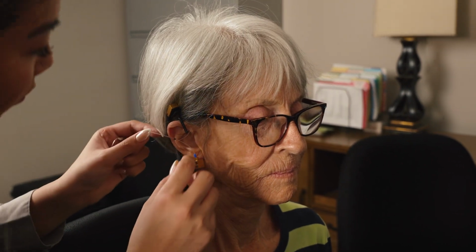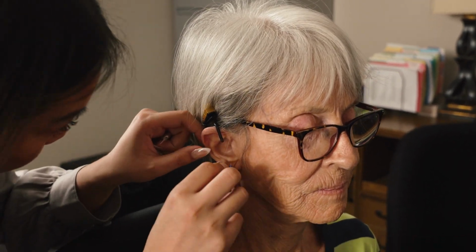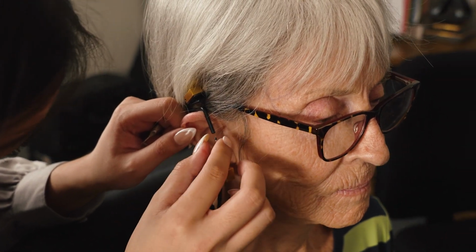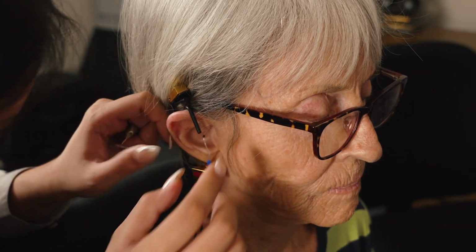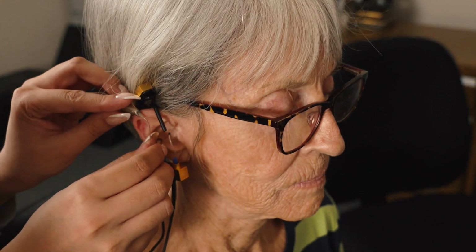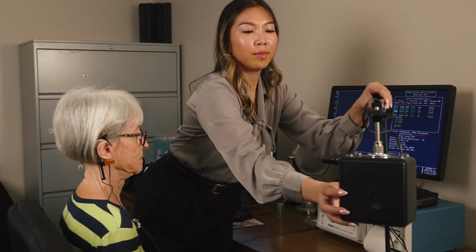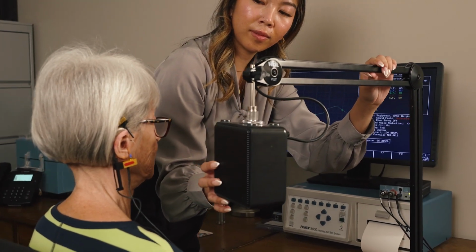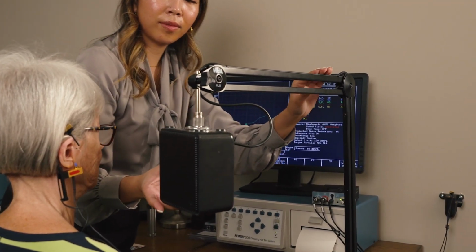A tiny tube from the real ear machine is placed in the patient's ear. This tube is connected to a microphone, which allows what the hearing aid is delivering to the ear to be measured. The hearing aid is inserted on top of the tiny tube, and a small speaker is placed about 10 inches from the ear in the hearing aid. The speaker delivers the sound that is used in measuring the hearing aids.